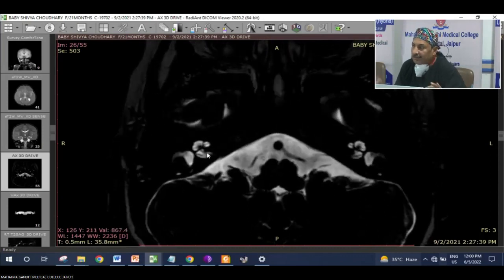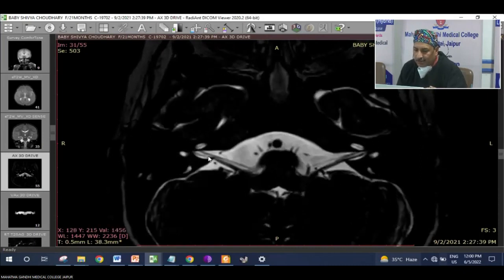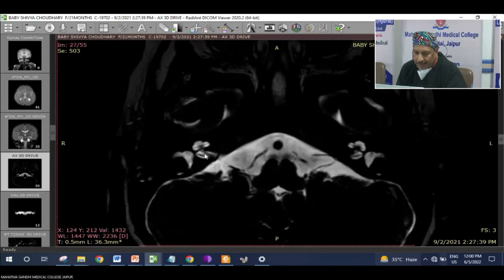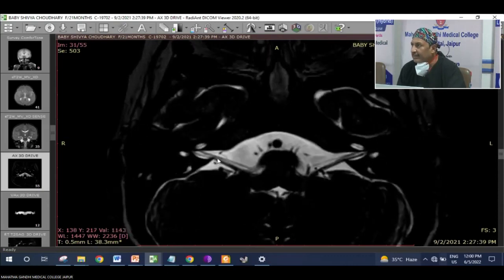And we all know why this is important to know. Even the worst result of the CI is better than the best result of the ABI. Even if we could push some electrode to stimulate certain aspects of the hair cells in the cochlea, we can get better hearing and speech recognition than the best results of the ABI. Now, how to look at the various nerves?